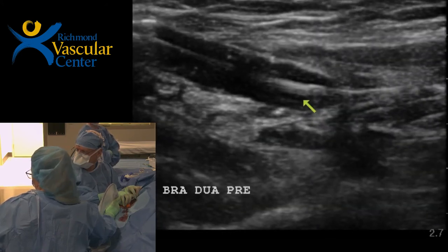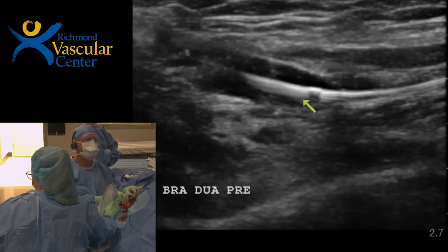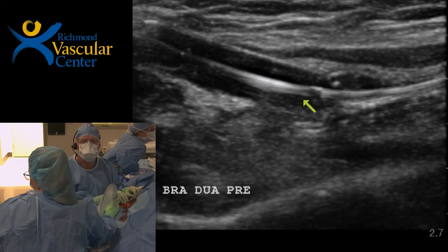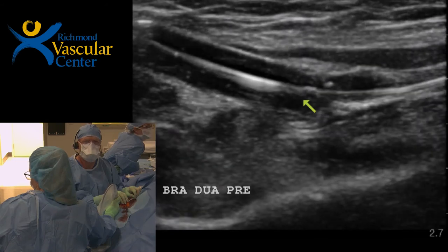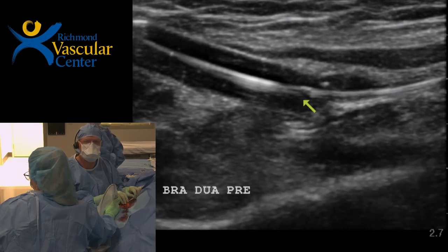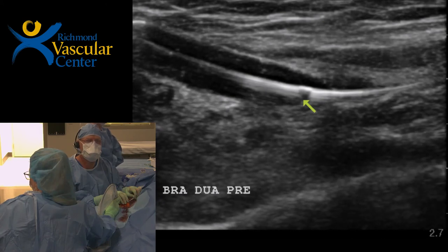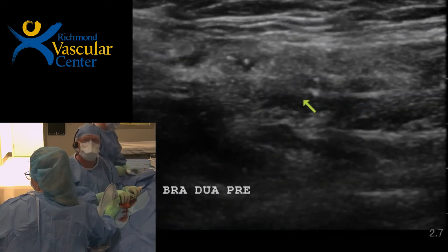Do you balloon dilate every patient? Always do. Partially because we were getting approvals to add that to our IFU, which we have now, and to show that it was safe, which we have. But also, you tend not to get adequate flow. One of the important things happening here is we're dilating the perforating vein to 5 millimeters. That will be required to get an adequate fistula in most cases. Then the next question is, did I really get the anastomosis open? If it keeps watermelon seeding out, I'll get a 4 millimeter balloon and make sure I really get that anastomosis broken up.